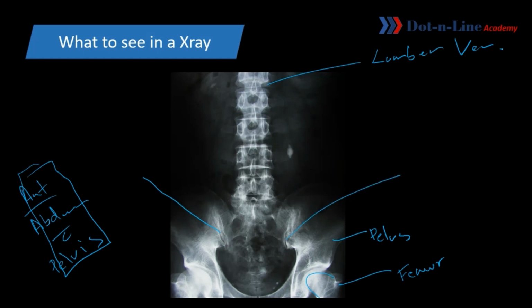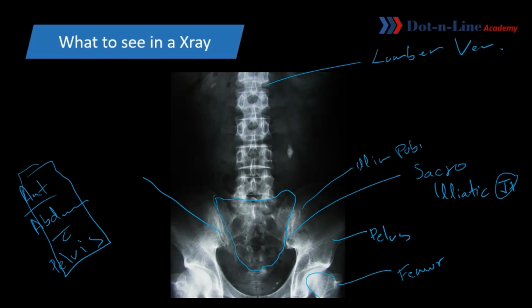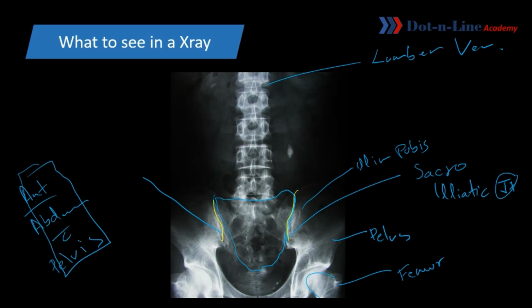It is a joint. So it is a sacroiliac joint. How? This is the sacrum bone. I'm outlining it. This is the sacrum bone and it is the ilium of pubis. So this joint is a sacroiliac joint. Let me change the color. This joint is a sacroiliac joint. It is not a fracture. This is also not a fracture. It is a pubic joint, pubic symphysis.